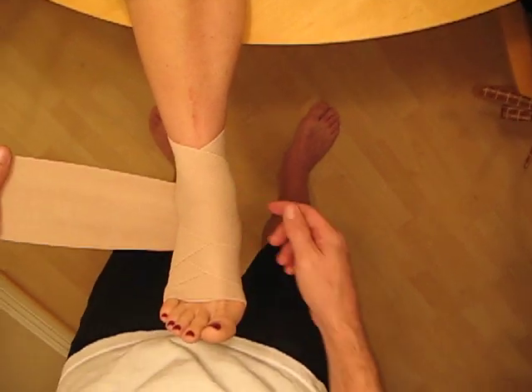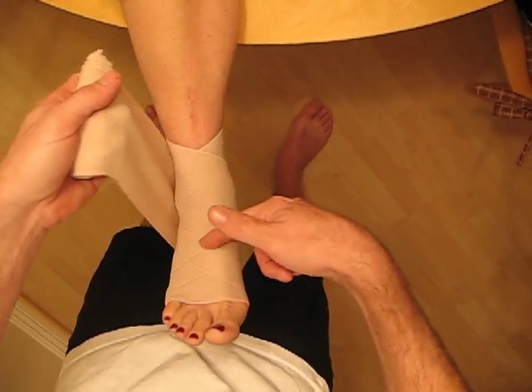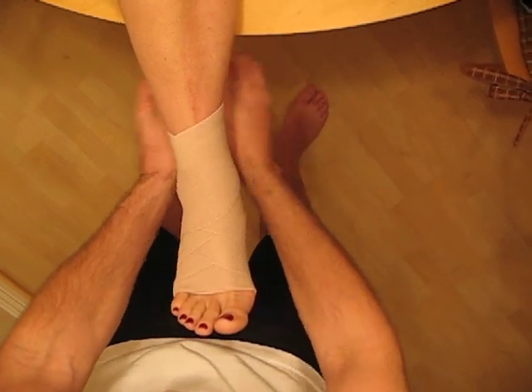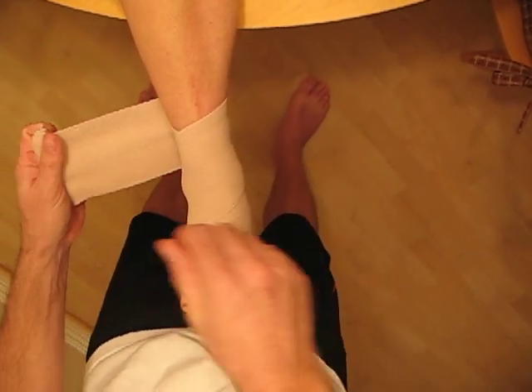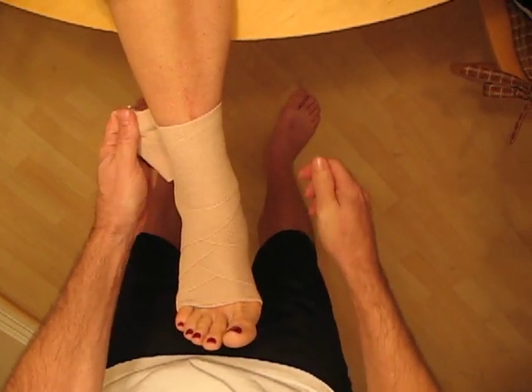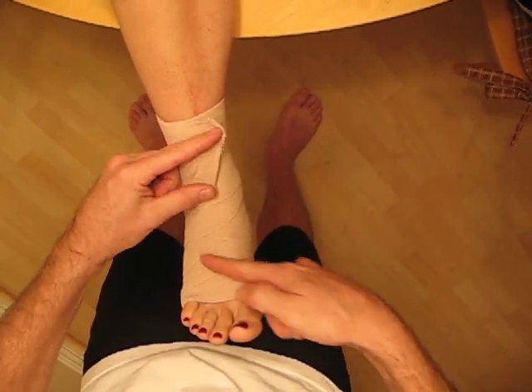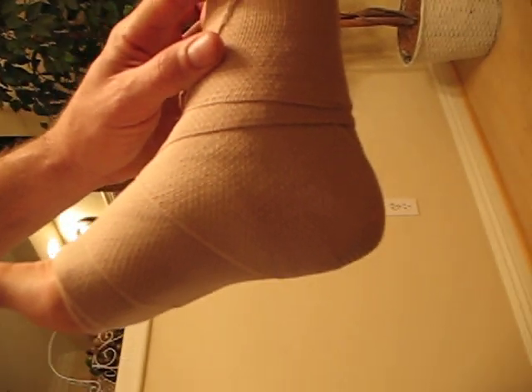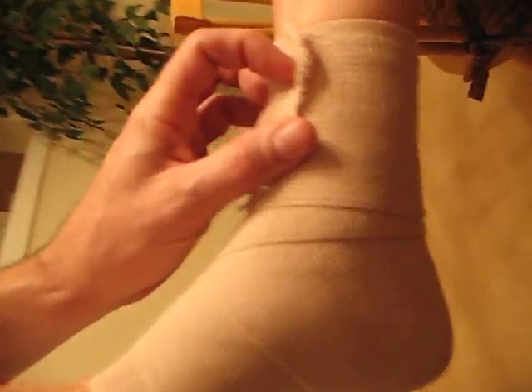This time I'm going to catch the whole bottom of the foot, or the heel. Again, same pattern up and around. And at this point, I've covered everything. Now I can just continue around and close it off. This is what's called the spica pattern — completely covered the heel, again, for compression.